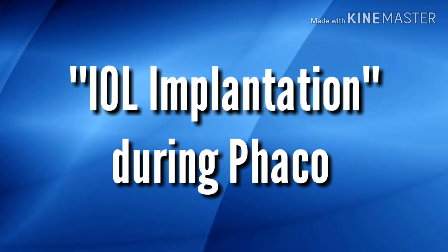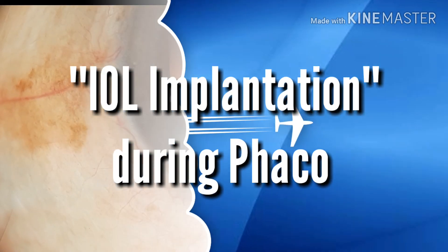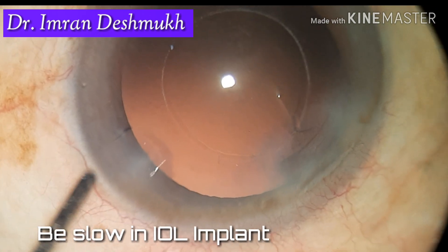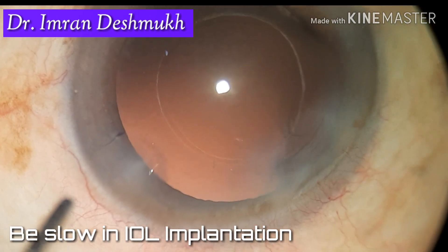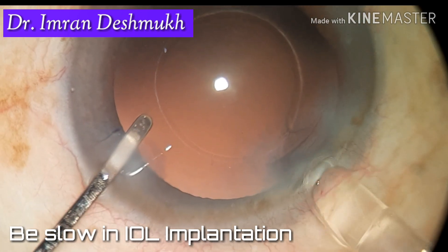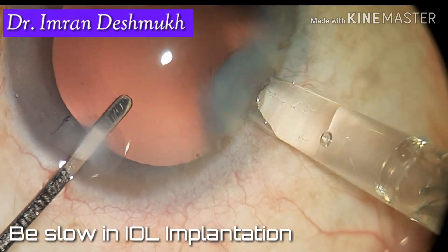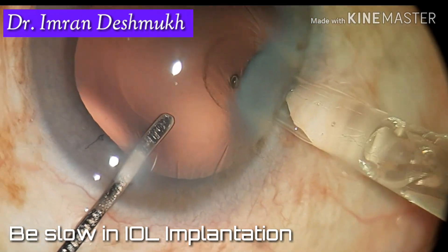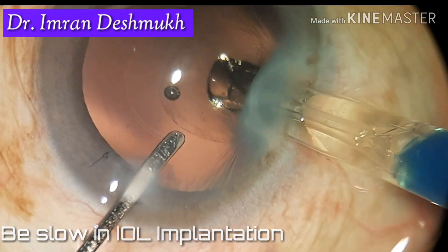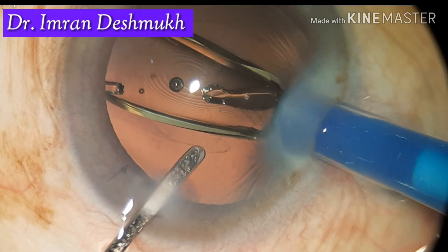Today we'll be discussing how to implant the IOL during phacoemulsification cataract surgery. Once the nucleus has been removed, fill the bag with viscoelastic. A good capsulorhexis of 5 to 5.5 mm is required. Insert the cartridge in the main wound and slowly inject the IOL into the bag.